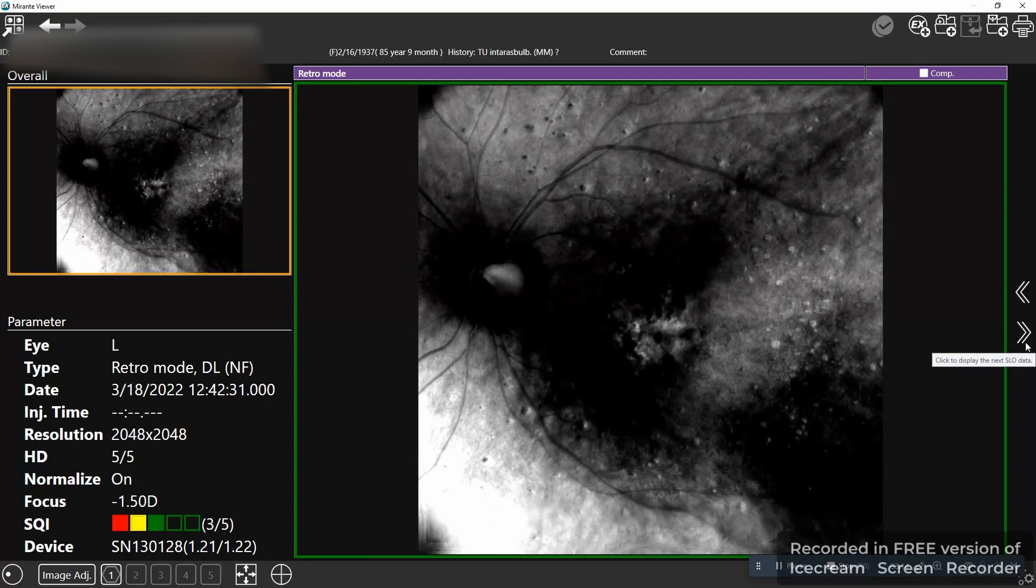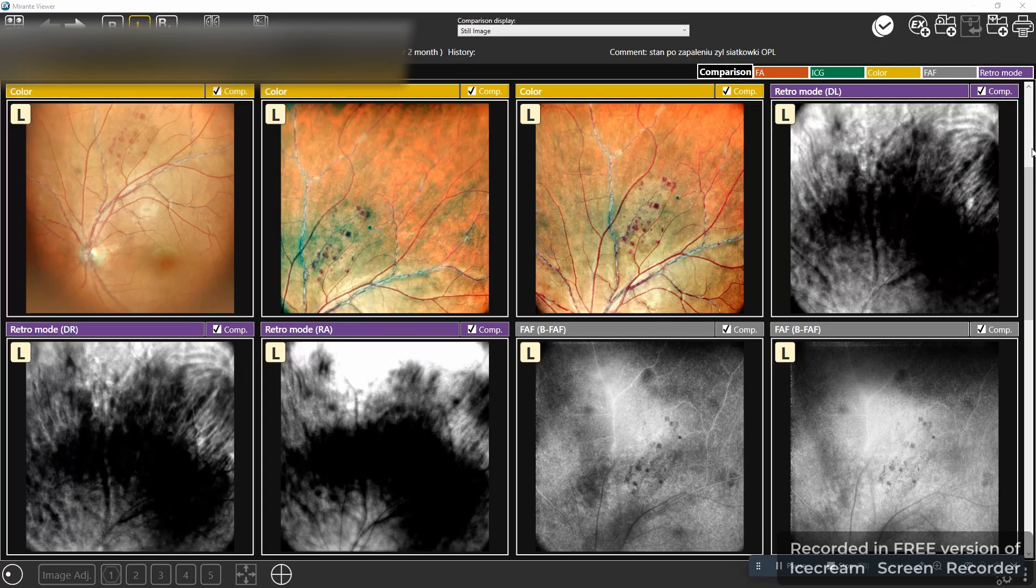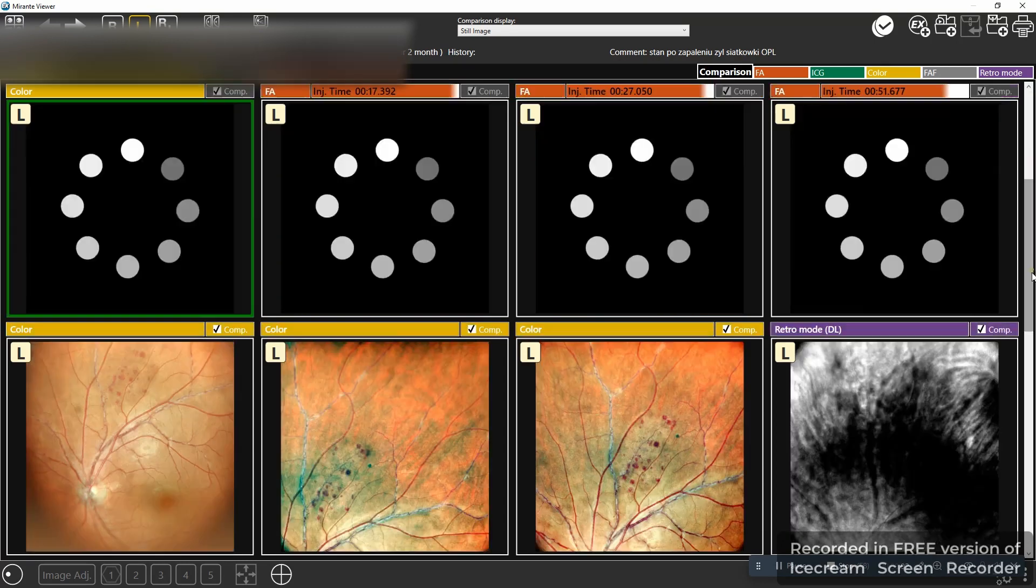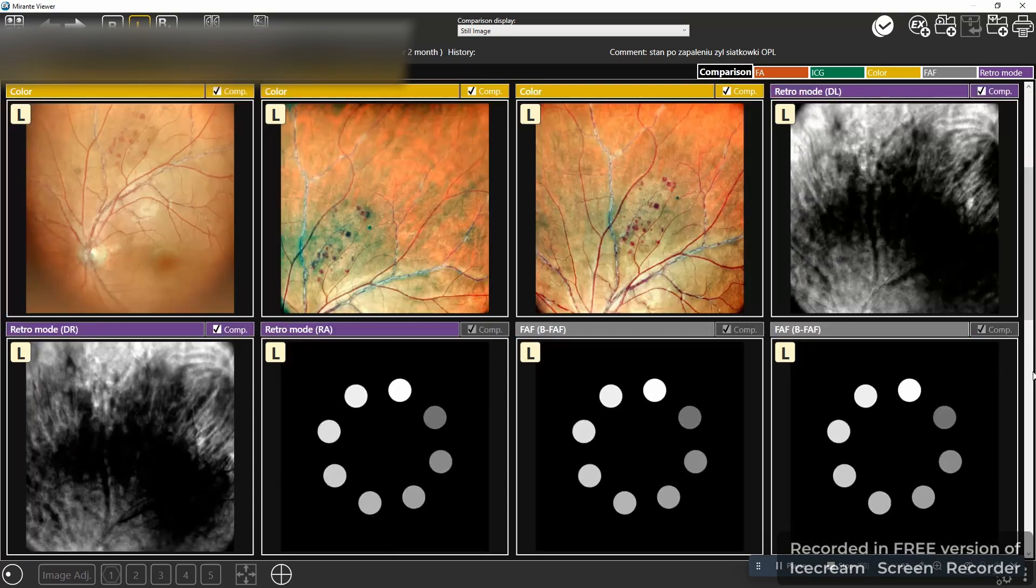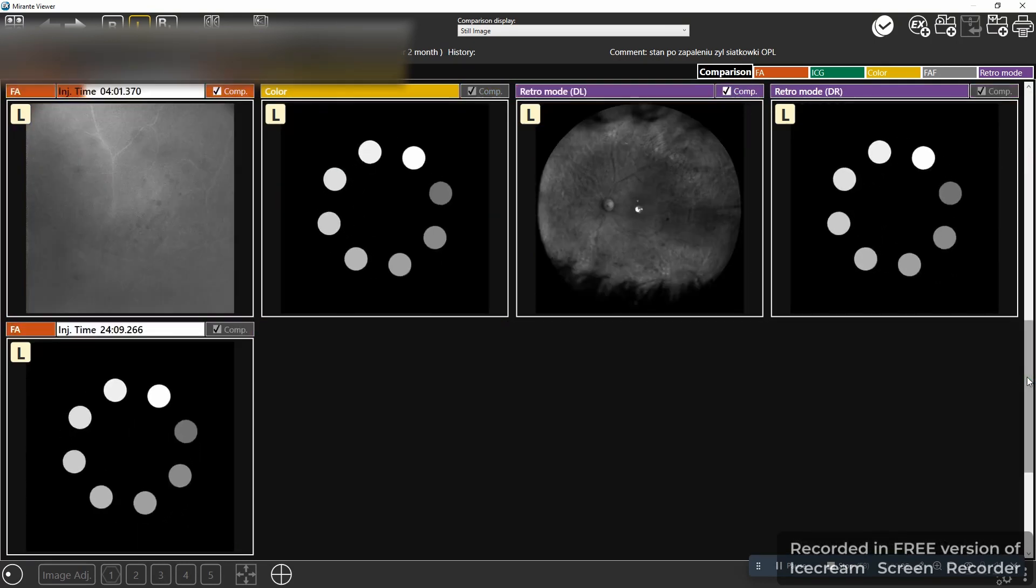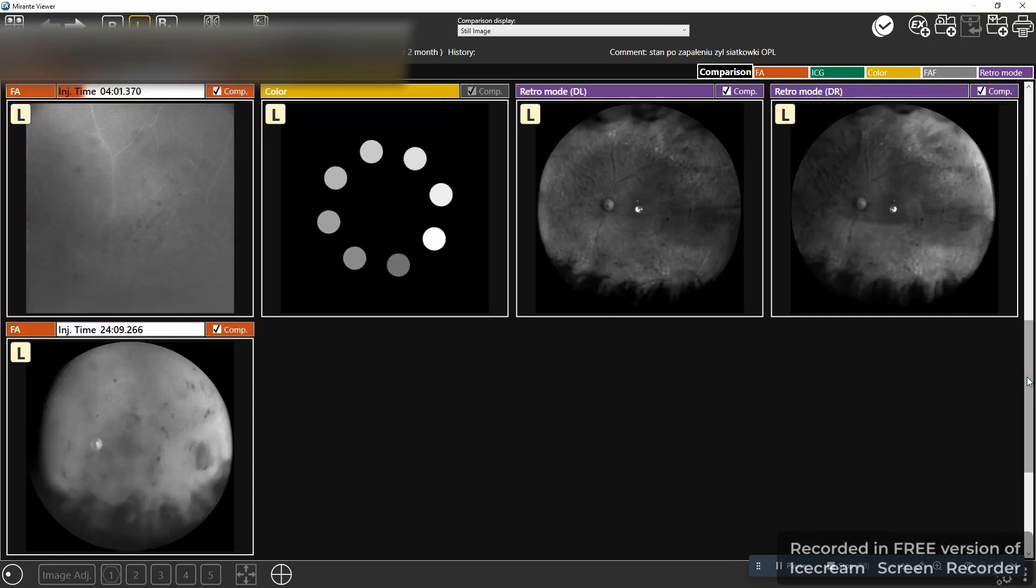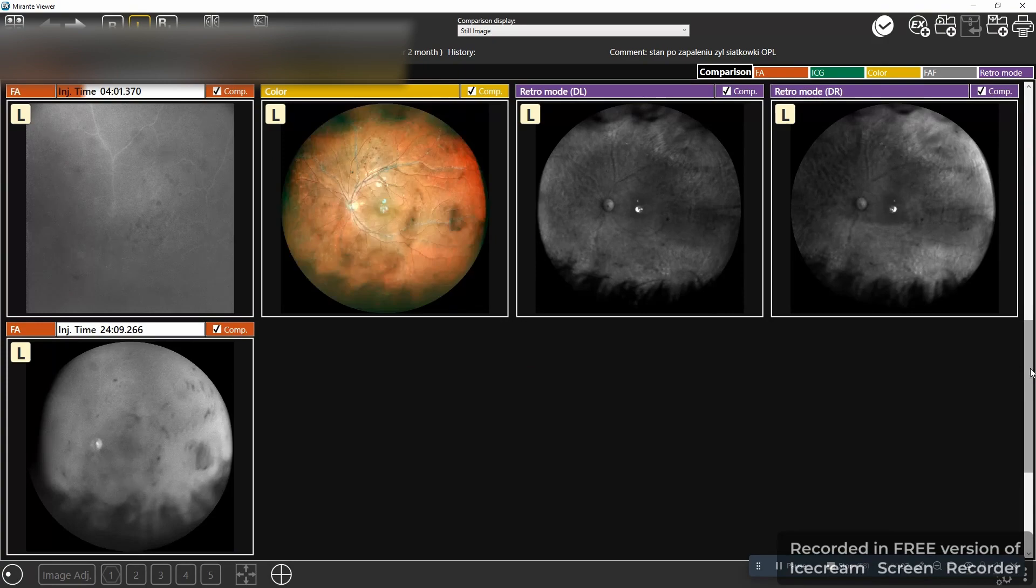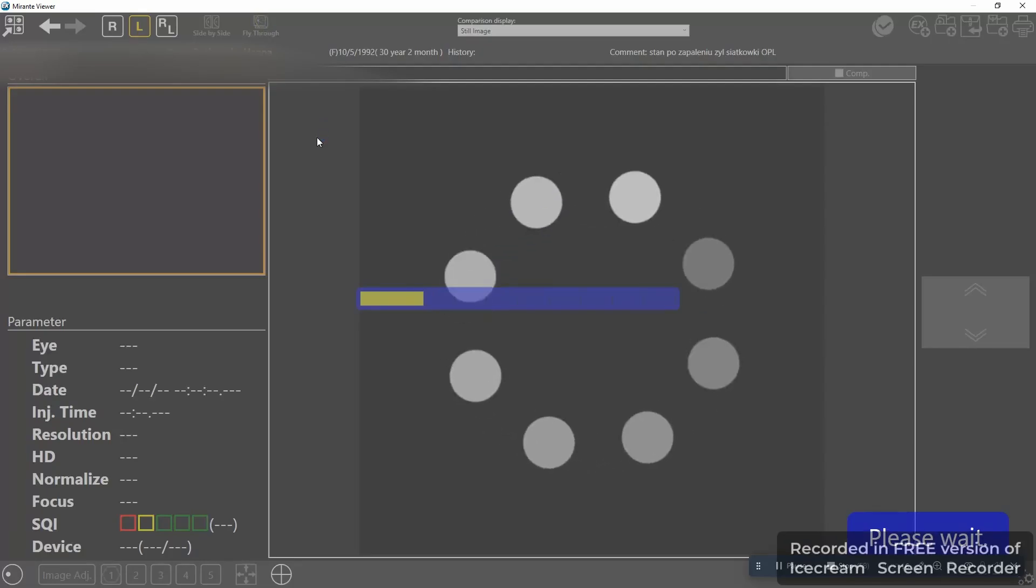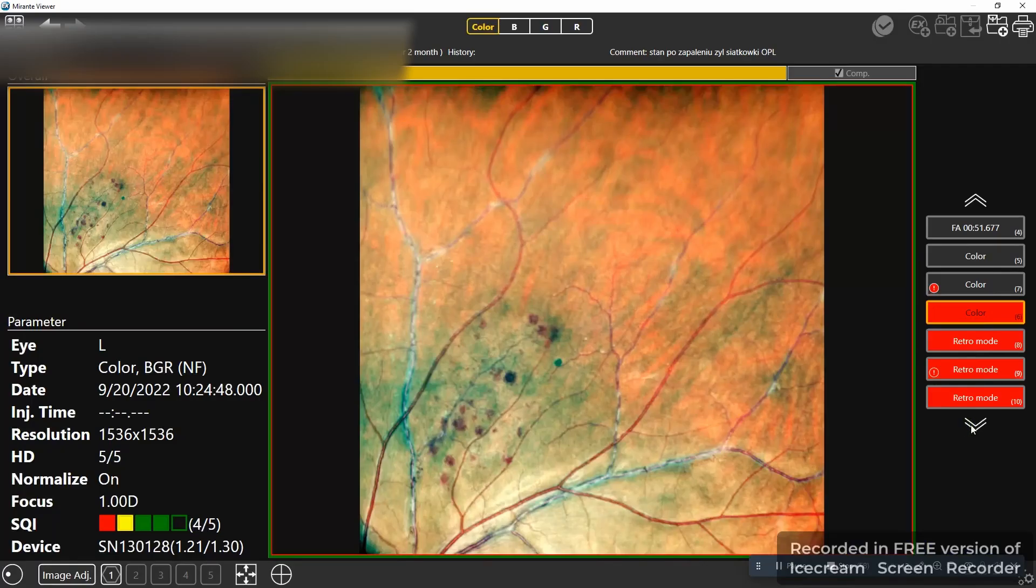Right now we are looking at something that's unique for Mirante which is the retro illumination. It's very nice for explaining to the patient. You can see comparison so all the modalities on one screen. There is something that's also amazing for this machine which is the fly by mode.